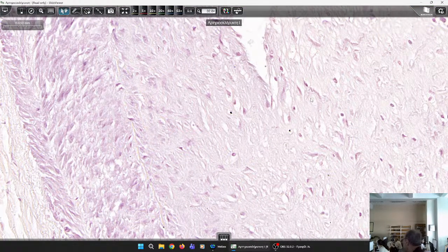If we have some rupture of small capillaries, a thrombus, a clot, forms, and so the whole lumen may become occluded, or the clot may leave and be an embolus and cause an embolism in some next part of the coronary artery. And what is the result? It is the acute infarct of the myocardium. So these are the constituents of the atheromatous plaque.